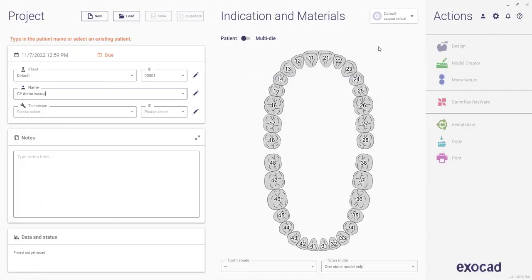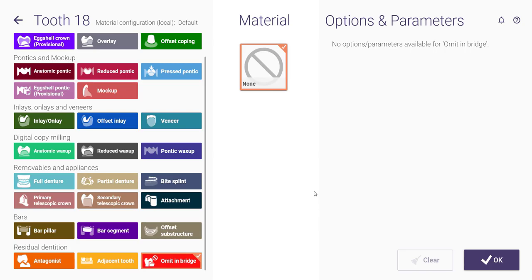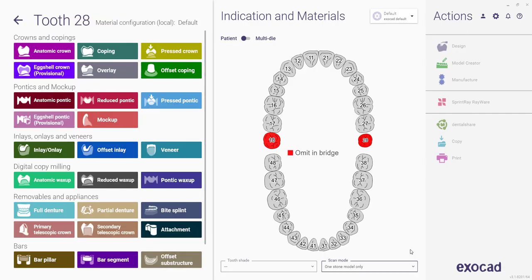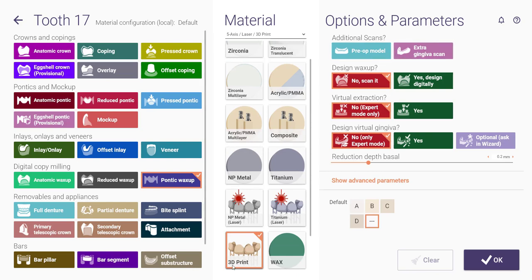I'm going to demonstrate this in ExoCAD. When you launch ExoCAD, you'll have to put in your stuff here. What I would like to do is a maxillary wax up. One of the things that kind of annoys me in ExoCAD is that you have to be so specific on your naming of stuff — you've really got to tell it exactly what teeth you're wanting to wax up. It's not like in Blue Sky where you can just add and remove. So even though we won't go back to second molars, I'm going to do a second molar to second molar wax up. I like to choose Pontic Wax Up. If you choose Anatomic Wax Up, you're going to have to define gingival margins and all that, and I don't really want to do that — I'm going to print this.